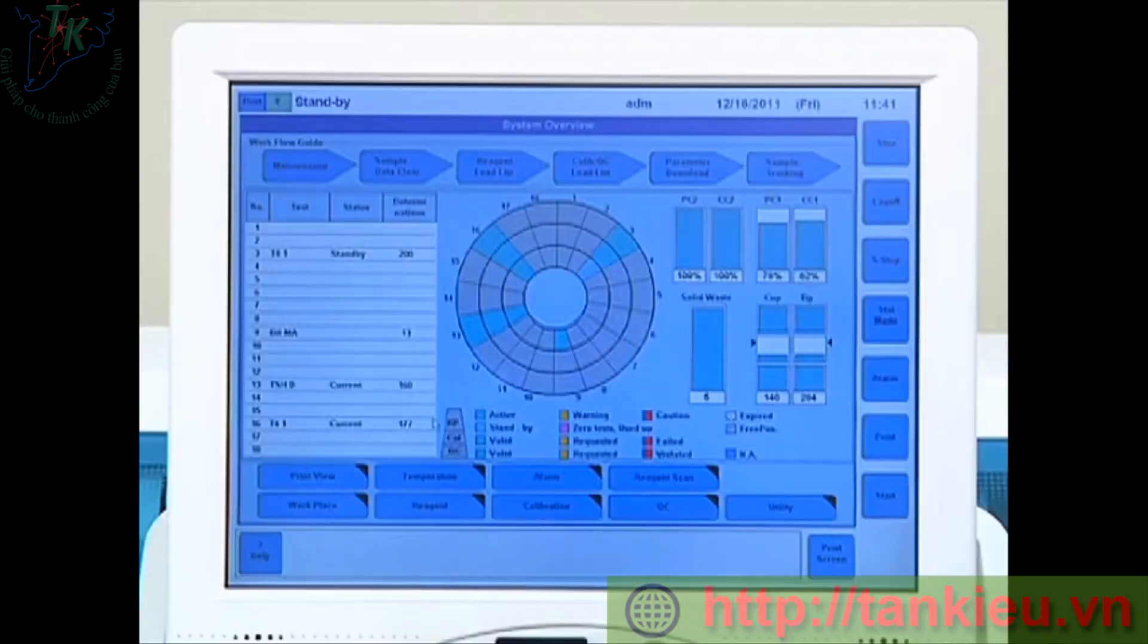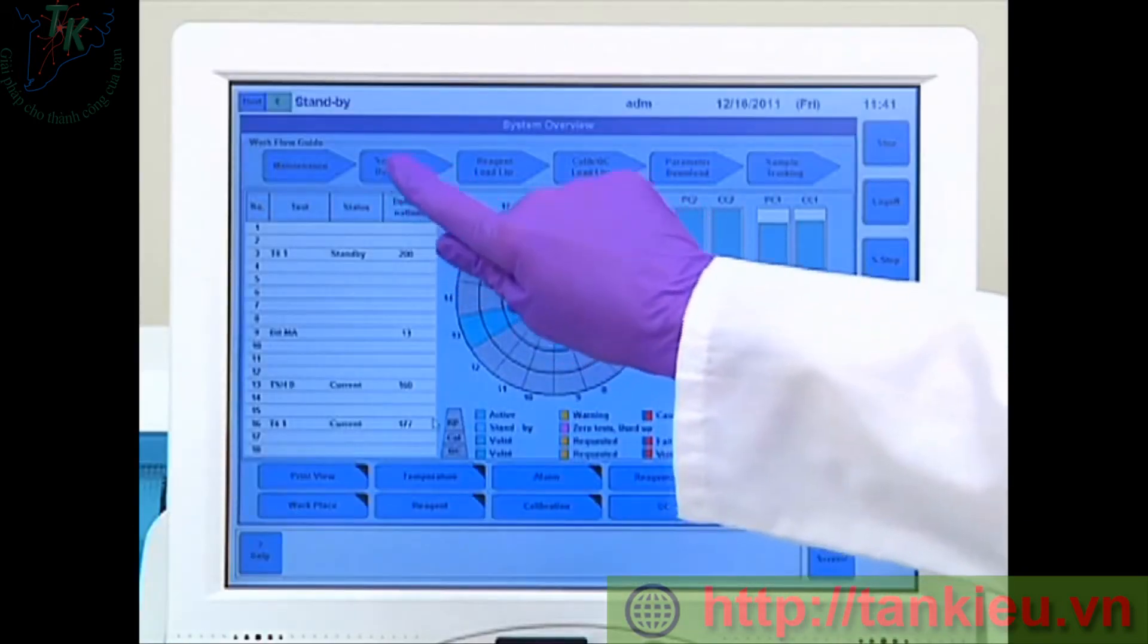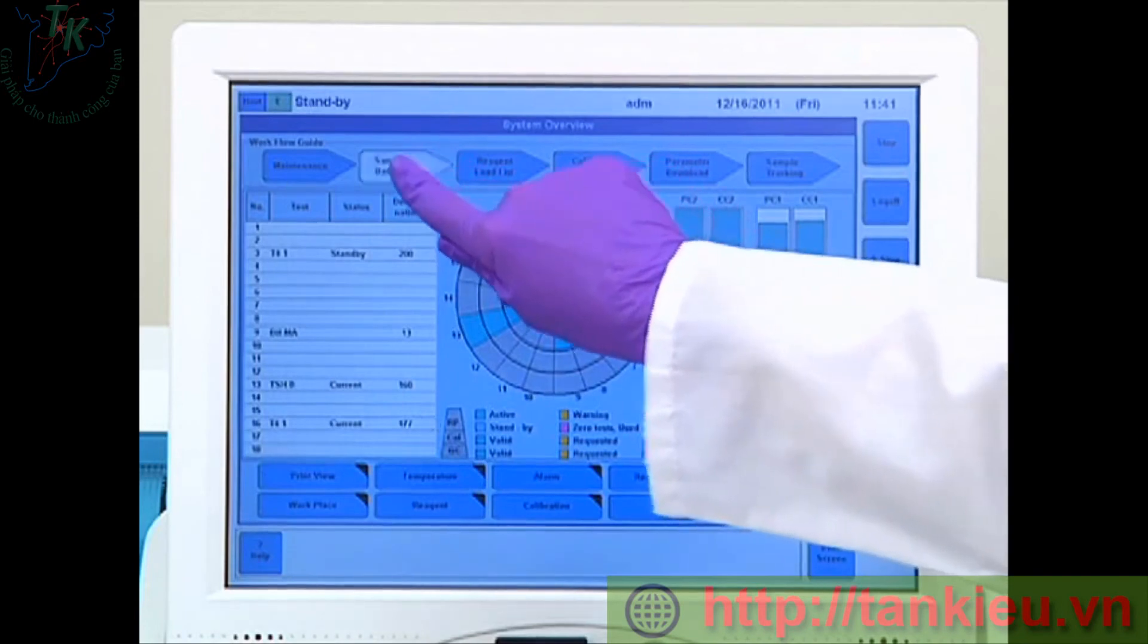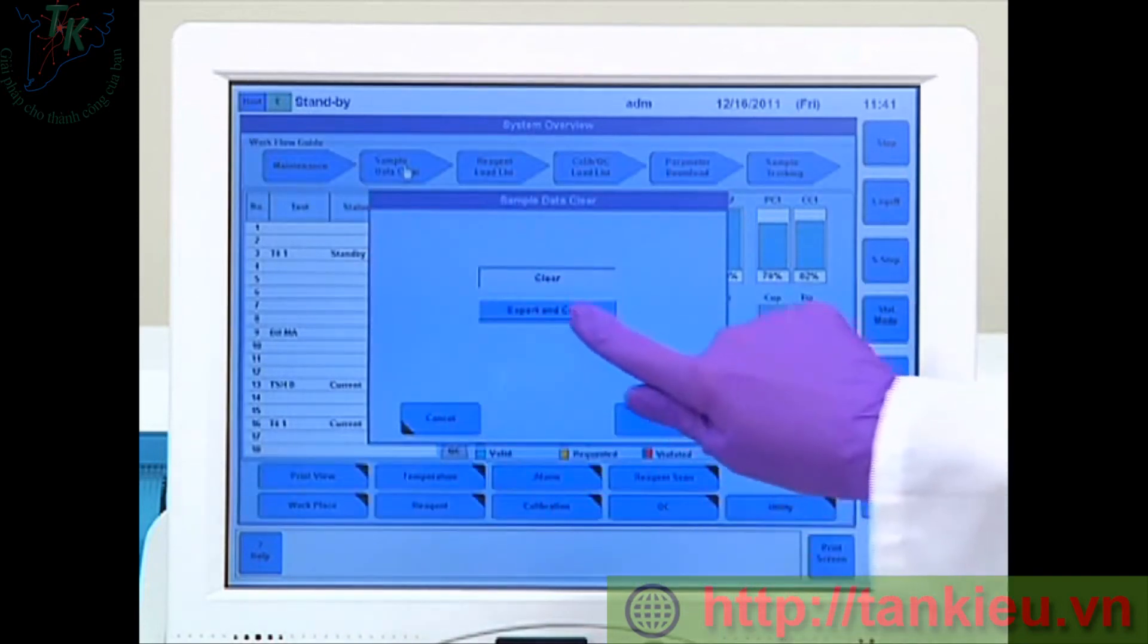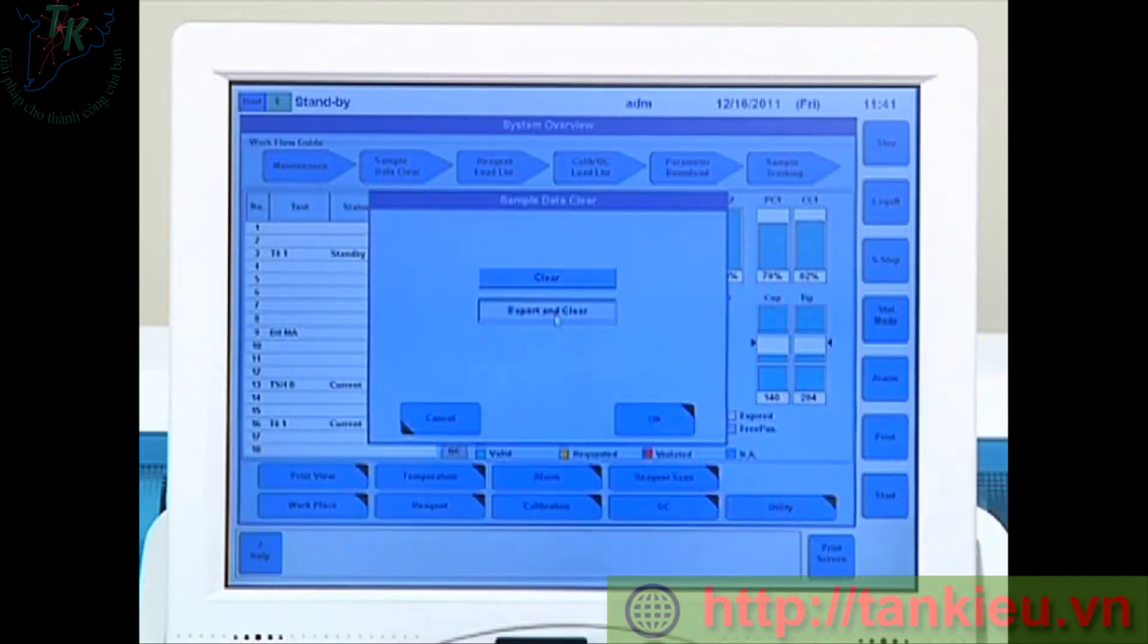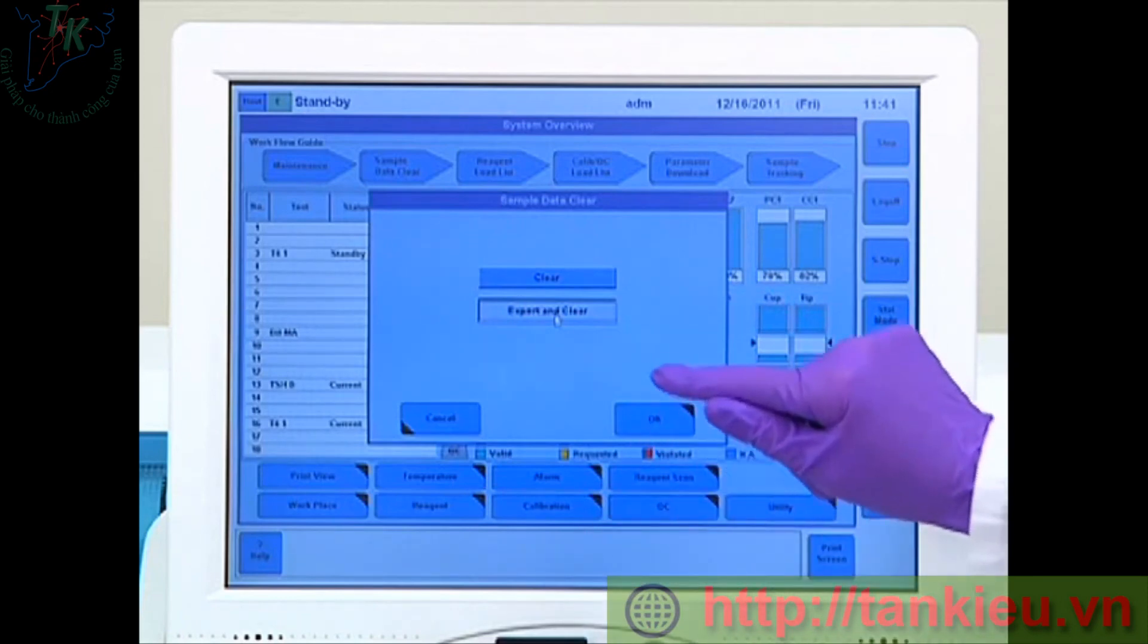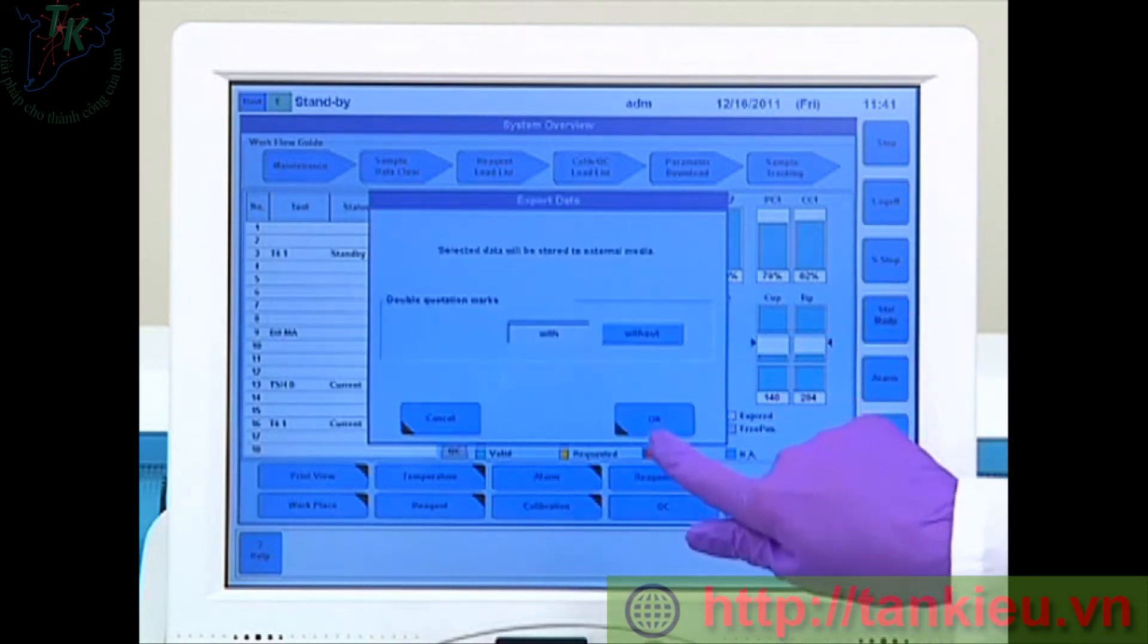Now I'm ready to prepare my calibrators and QC. Before I do that, I'm going to perform a sample data clear through the system overview screen. What this will allow me to do is to actually export my data to a DVD so that I would be able to retrieve it on another computer. So after I have selected the sample data clear and backed up my data, I'm ready to determine what reagents may need calibration.